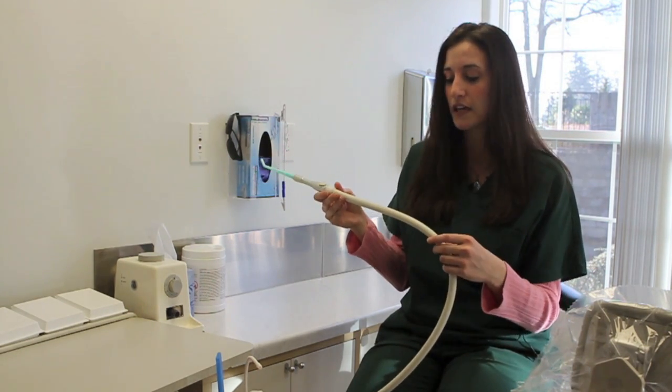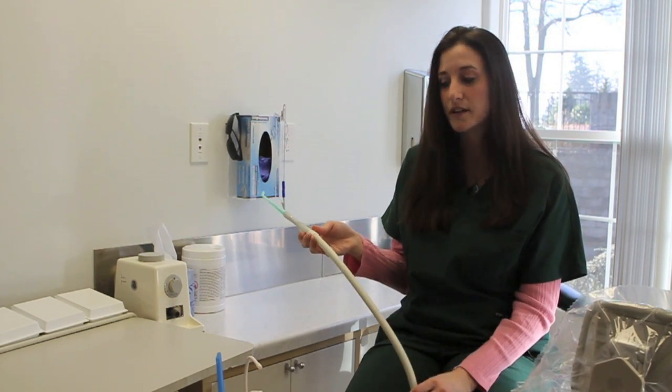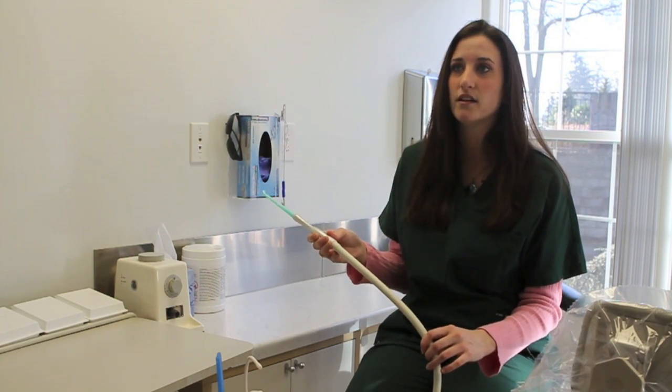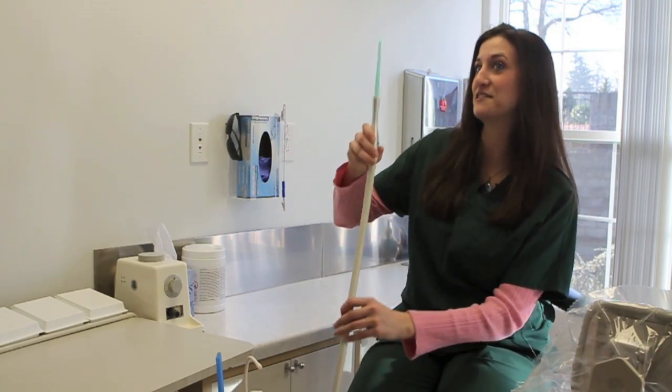When you have nice looking materials and nice looking products in your operatories, it just makes it that much better, because patients can see the good quality and they know that the service they're getting is also going to be good quality because of using good quality material.